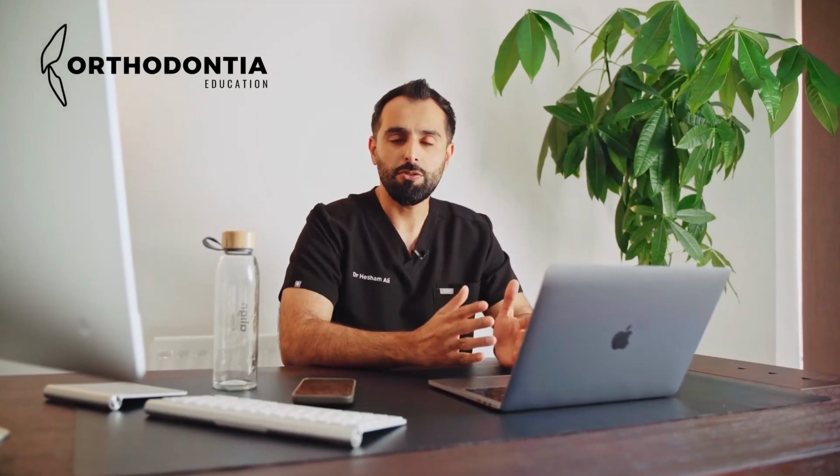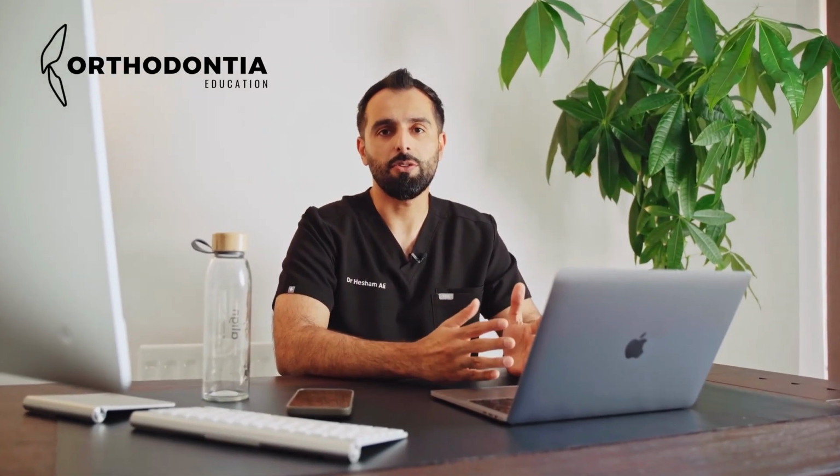You can reduce the amount of time you spend on your aligner simulations by ensuring you submit the records in the right way. My name is Hisham.